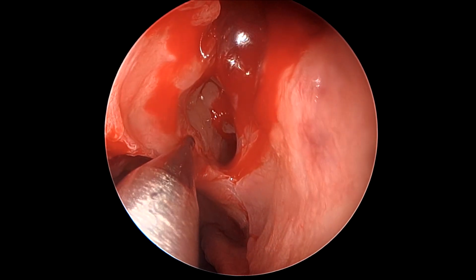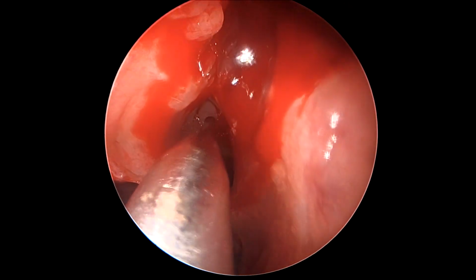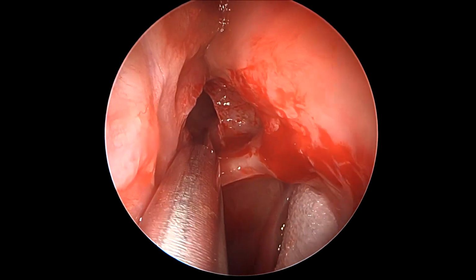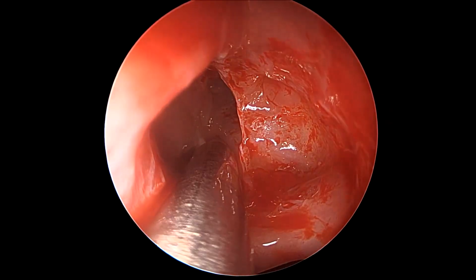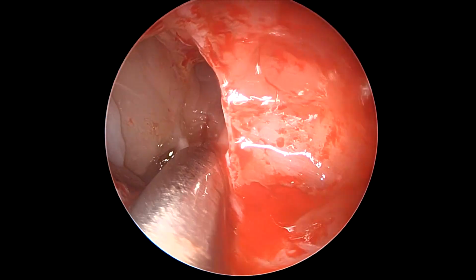So as we had remarked on the CT, the sphenoid was more or less clear. However, there was opacification and disease in the ethmoids, both anterior and posterior. That would need to be cleared. Even here one can see a reasonably patent sphenoid sinus behind and some polypoidal and scar tissue in the ethmoid sinuses.